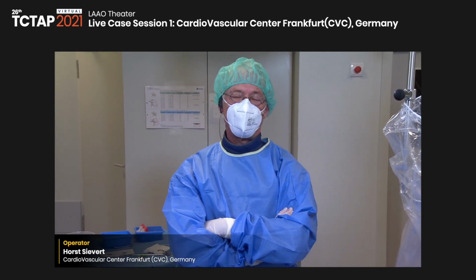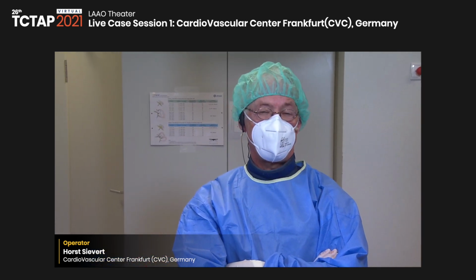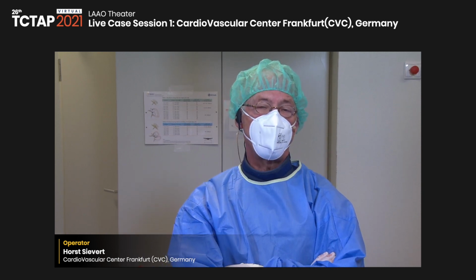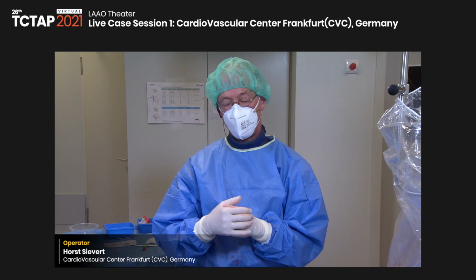Yeah, that's a good question. So I go for the largest diameter in any imaging technique. So if the largest diameter is measured on angiography, then I take that. If the largest diameter is measured on TE, I take that. The good thing with the Watchman Flex is that it is so much forgiving regarding the size. So in theory, you could close every appendage with the largest device because there's no harm to overcompress the device, which is also a difference to Amulet. With the Amulet, as you know, when you oversize, actually there's a risk that it is kind of squeezed out. This is not the case with the Watchman Flex.